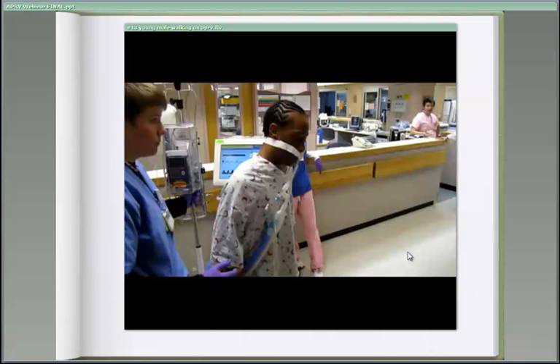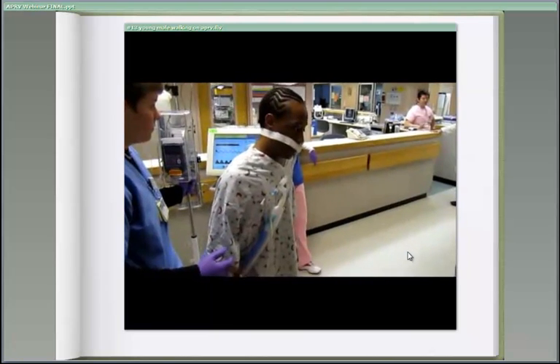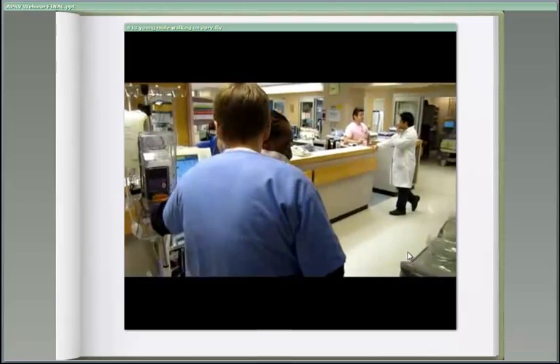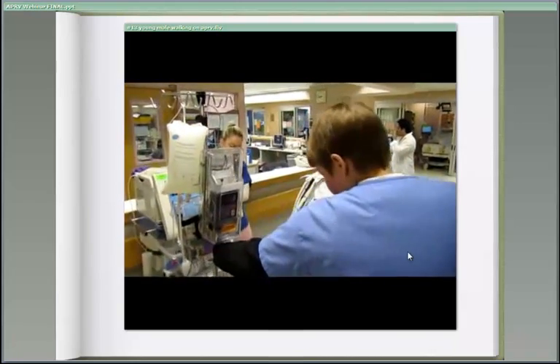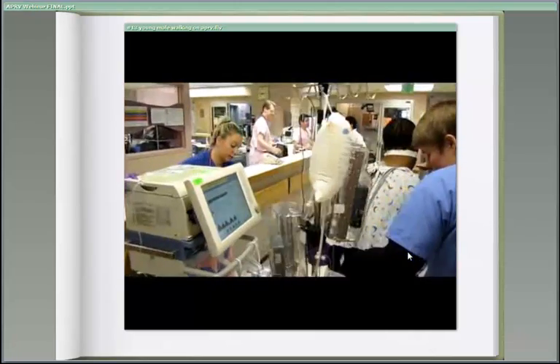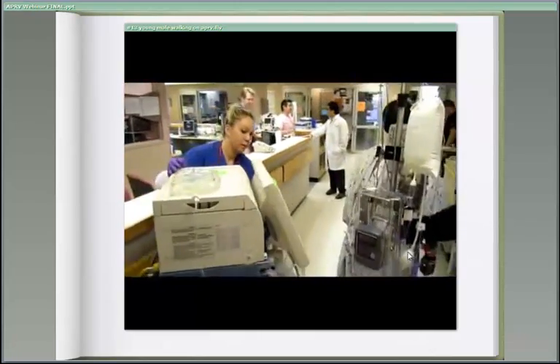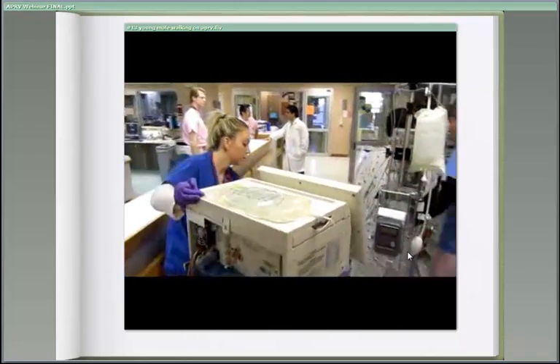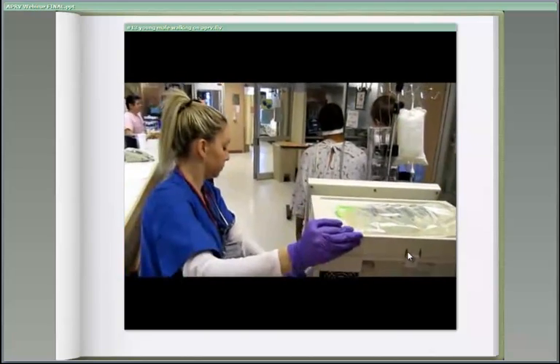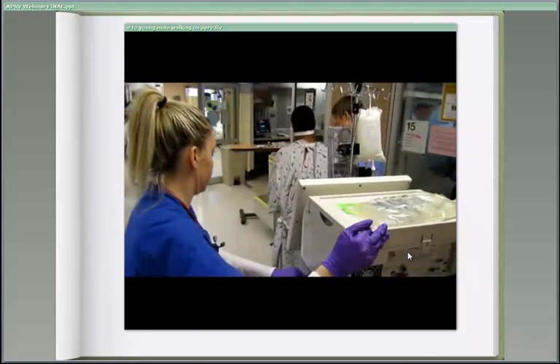Now what I'd like to do is show you some videos of how we use APRV in our center. These are just some examples. This is typically what we do with APRV, because we use it from intubation all the way to extubation. We use it in severe respiratory dysfunction all the way to the weaning, and in this case you can see ambulatory patients. And the patients are quite comfortable breathing. I guess you could argue their work of breathing is high, but that's only because they're walking around.